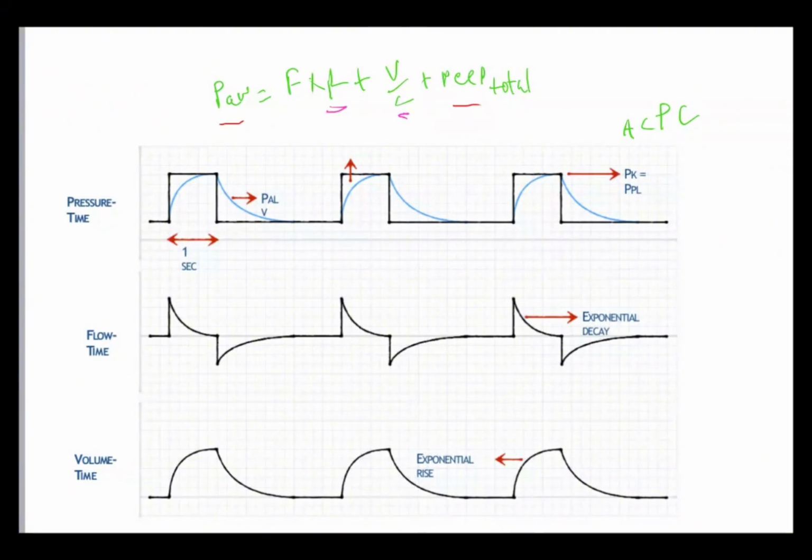Now, whether that's more sedation or paralysis or switching modes or whatever you deem to be appropriate, while we want the patients to be sort of in control, we also understand that there's situations where they might need to have less control because of their pathology. So we start at pressure control. So we set the airway pressure.